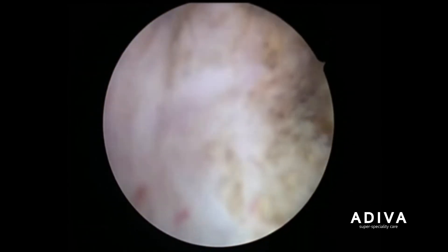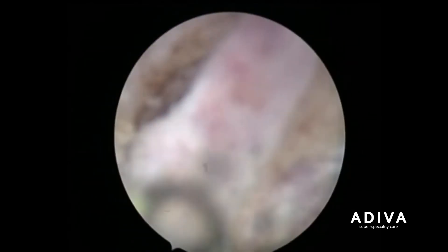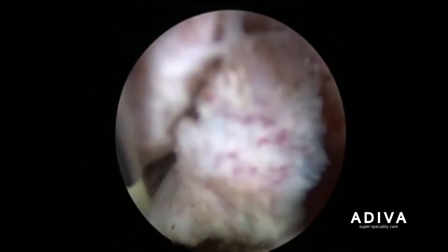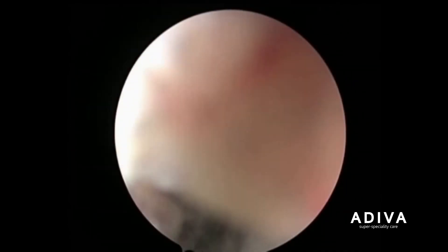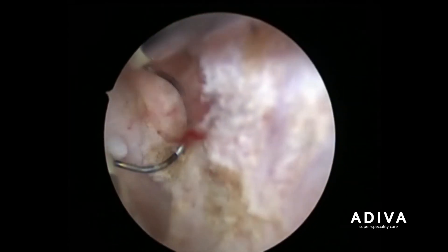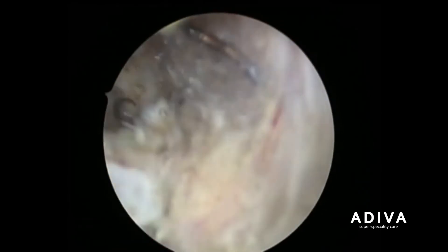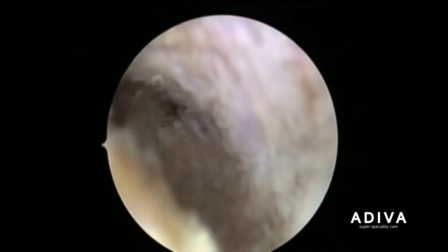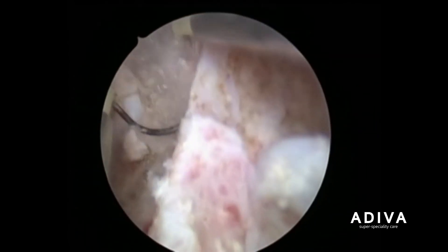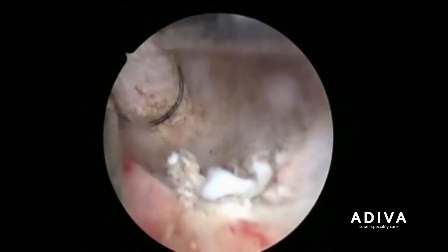Blood loss is also not very significant. The vision is very clear and the prostate tissues are removed — by evacuation we are able to take out all the pieces which go inside the urinary bladder at the end of the procedure. At the last you will find a complete cavity made up of the capsule of the prostate where the gland has been removed completely.